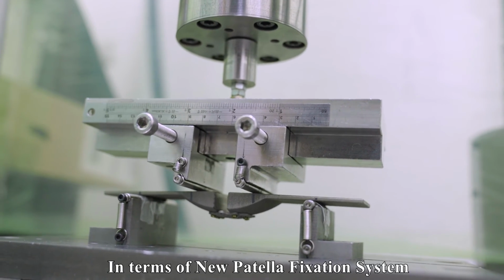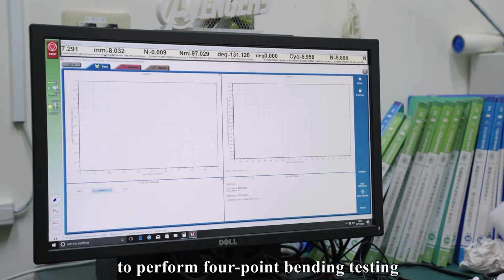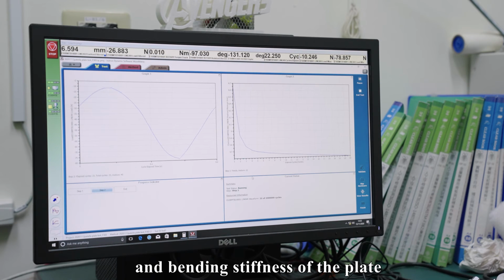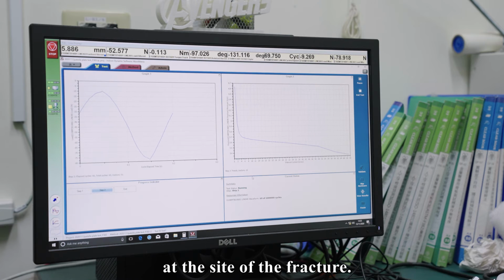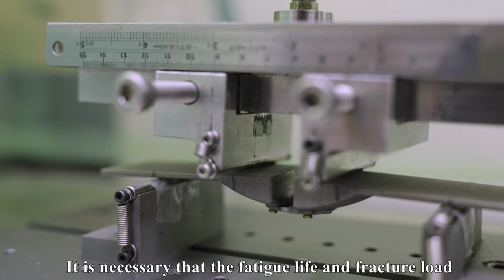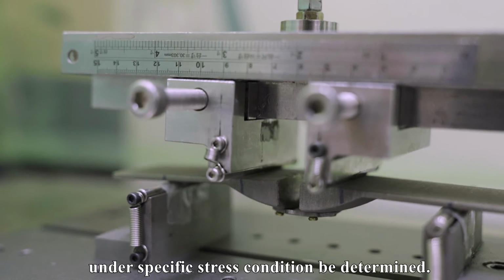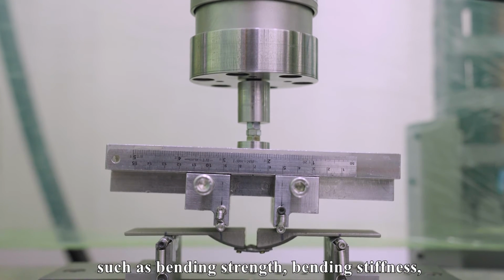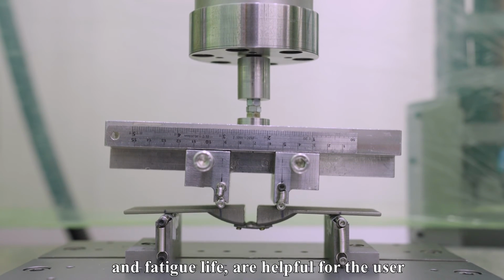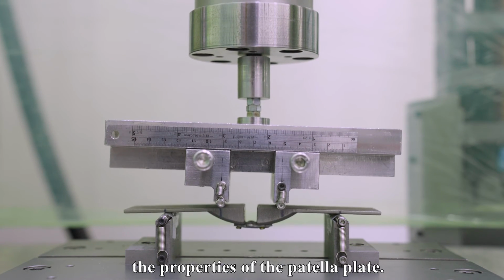In terms of the new patella fixation system, we refer to ASTM F382 to perform 4-point bending testing so that we realize whether the bending strength and bending stiffness of the plate are large enough to stand the stress that occurs at the site of the fracture. It's necessary that the fatigue life and fracture load under specific stress conditions be determined. The bending performance and fatigue performance, such as bending strength, bending stiffness, and fatigue life, are helpful for the user and the designer to realize the properties of the patella plate.